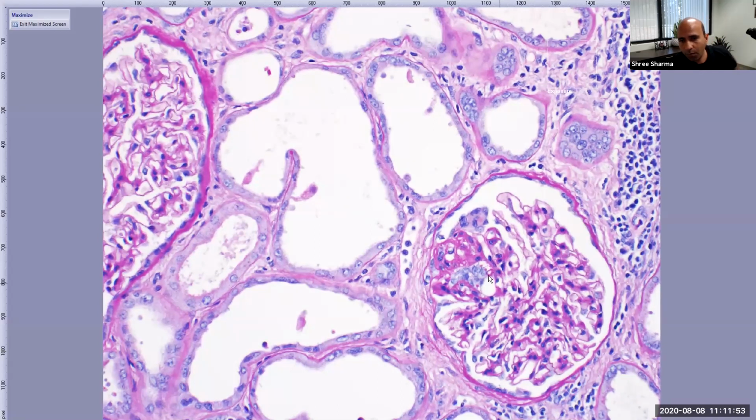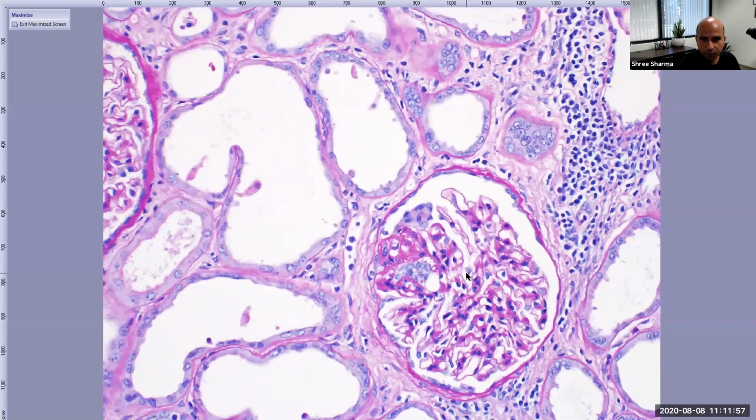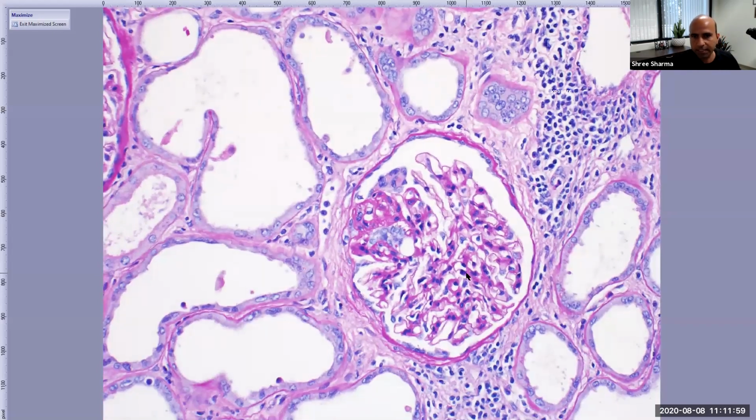And I can understand why he thinks this can be a nodular one. So let's focus specifically on this glomerulus. Nodular mesangial sclerosis means the lesion has to be mesangial based. If this was going to become a nodular sclerosis, this area would expand gradually and form a nodule. In contrast, in this one, the segment or part of the glomerulus is sclerotic and obliterating.